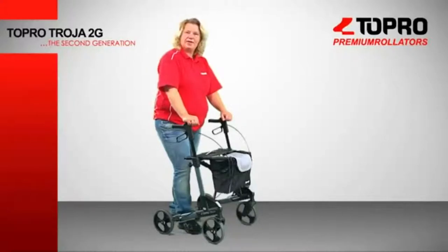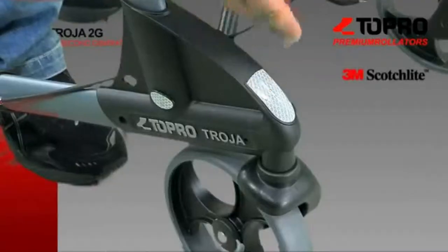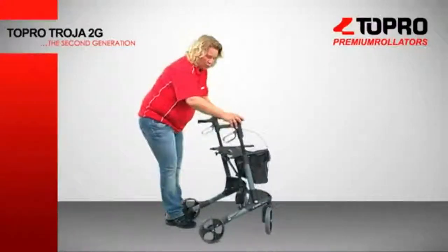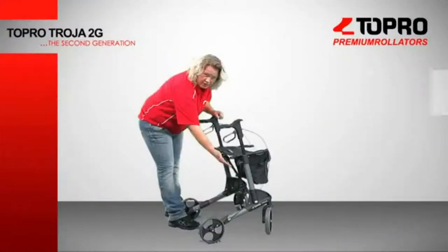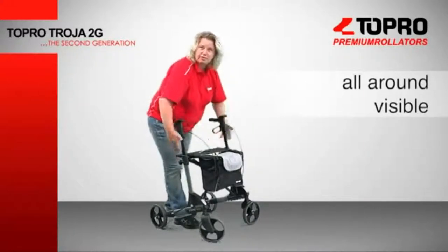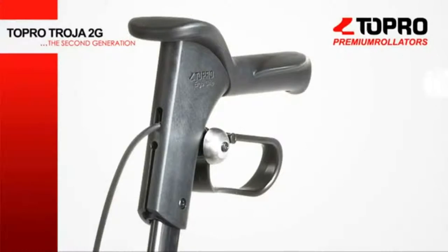To increase safety, we have added six reflectors on the rollator: two in the front, one on each side in the basket, and two in the back where they are red. So now there are reflectors all around the rollator. We've equipped the basic configuration of the 2G with a bell so that you are able to alert those in the immediate vicinity whilst using it.